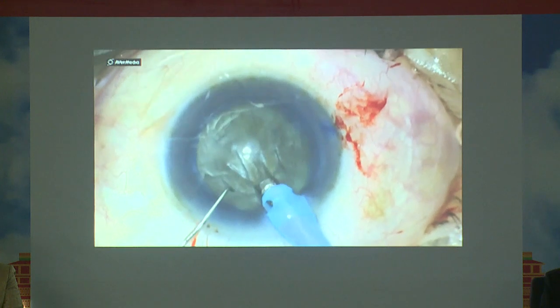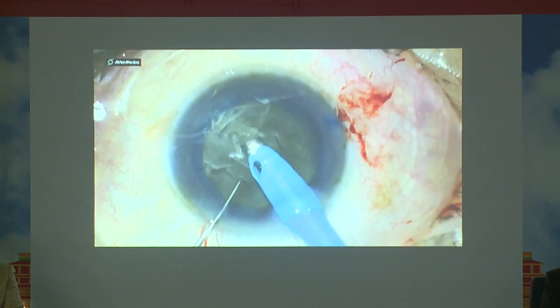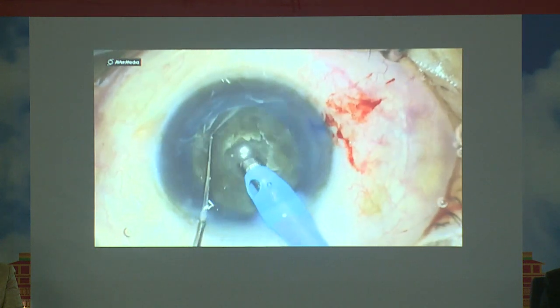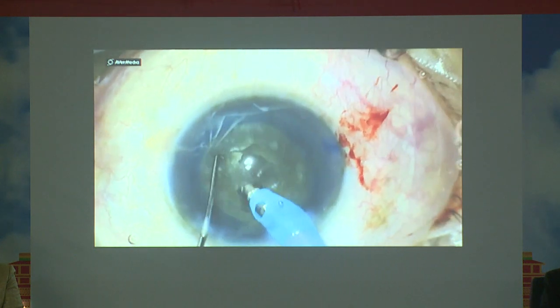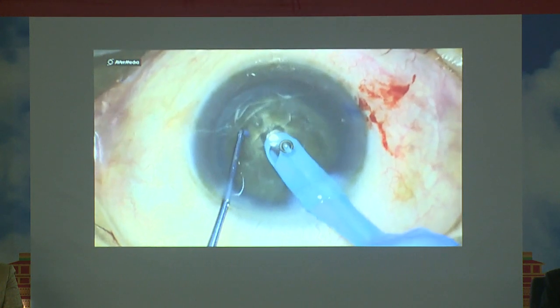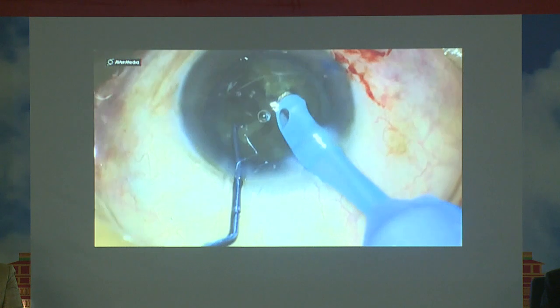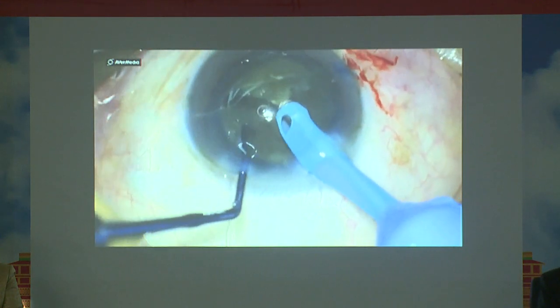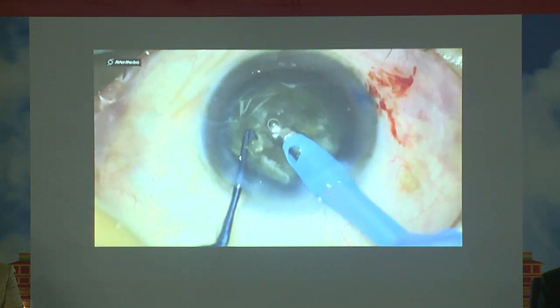And this is the phaco. We make a certain central crater in this case, because making the central crater definitely weakens the central core of the nucleus. And this is the direct chop. And we should try to separate at least up to the center of this cataract.